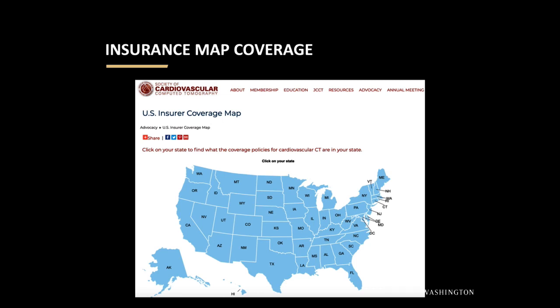Well, I think I can maybe answer that question for a coronary calcium score looking at atherosclerotic burden. And it does seem that the calcium increases by about 20% per year in the normal range. The question about coronary CTA and how plaque progresses, I don't know that off the top of my head. I don't know if you have that.